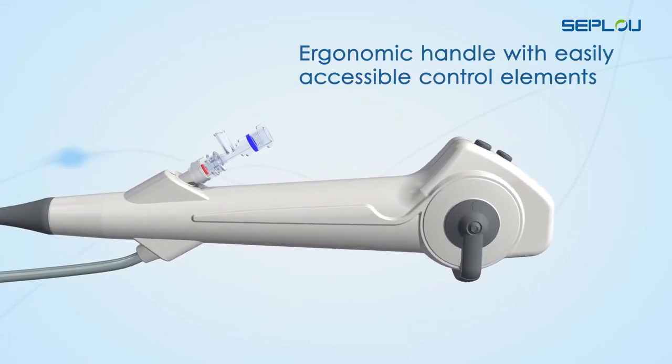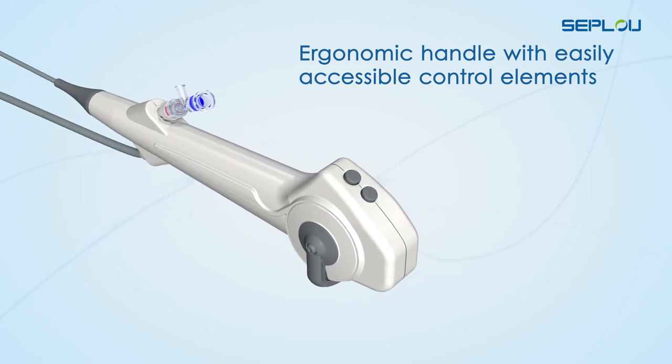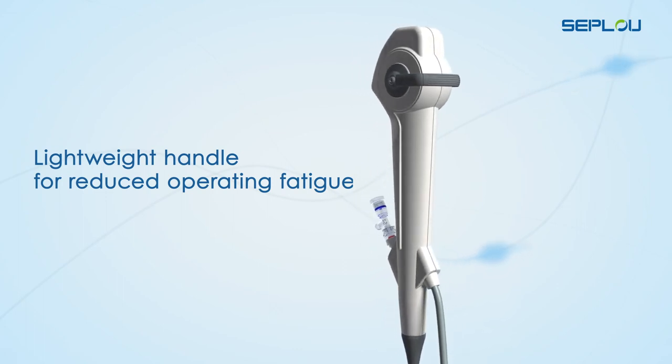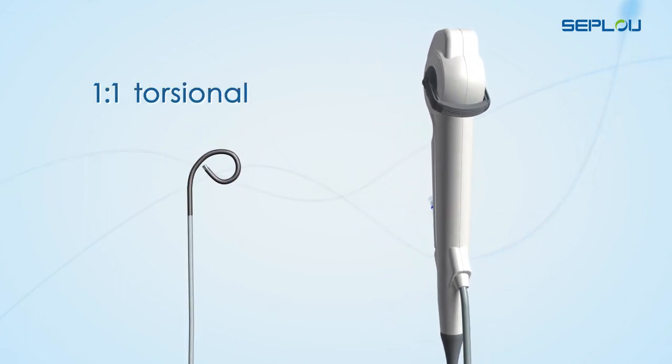Ergonomic handle with easily accessible control elements. Lightweight handle for reduced operating fatigue. Perfect control with 1-to-1 torsional stiffness.